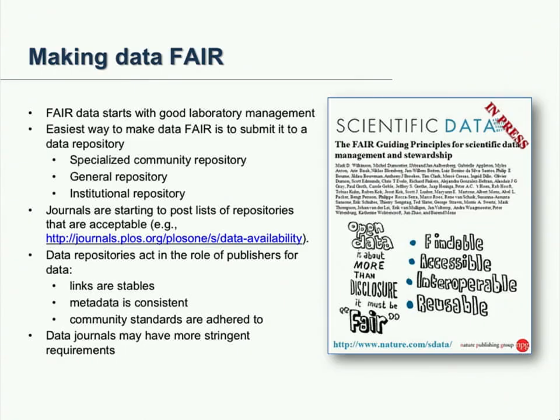You take a subject, they go through a number of scanning sessions, you capture a number of types of imaging modalities. Seems pretty logical, but the number of variants one can come up with as how to handle that is interesting.